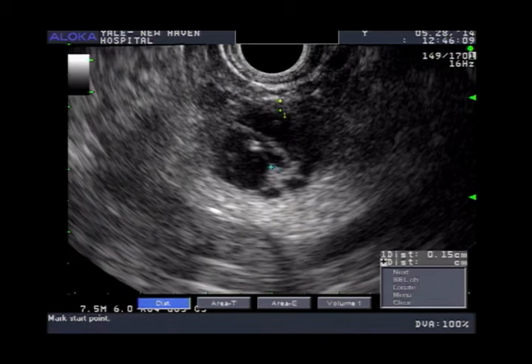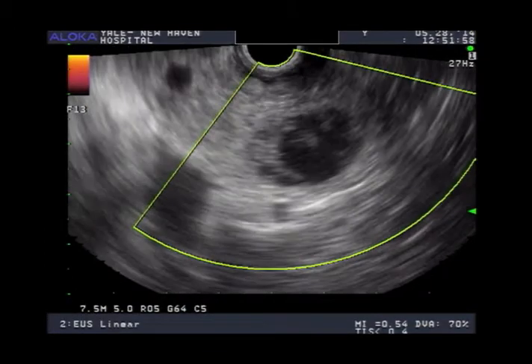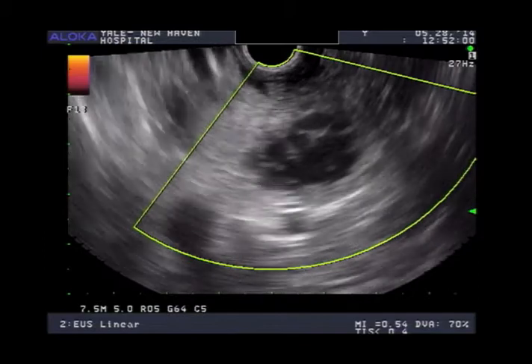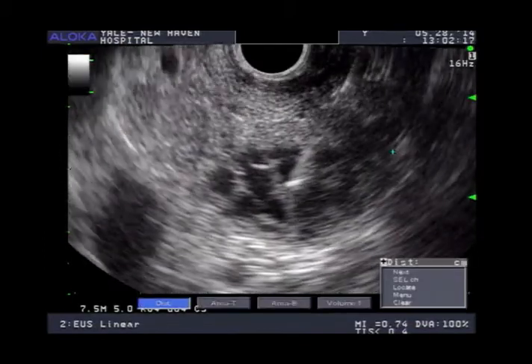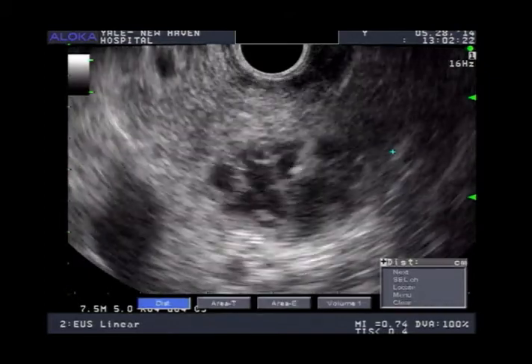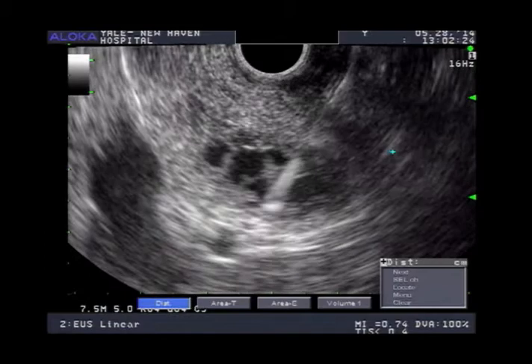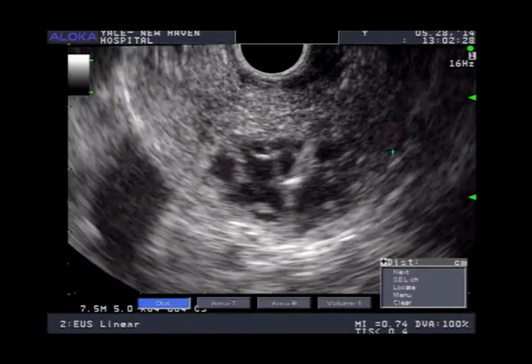In addition to measuring the cyst diameter, the thickness of the cyst wall and septations should be measured as well. Doppler should be used to determine presence of blood vessels around the cyst. Following Doppler study, a thickened septation and the cyst wall are targeted for FNA. Repeat sampling of a septation is seen here. Cytology was diagnostic of a cystic neuroendocrine tumor.